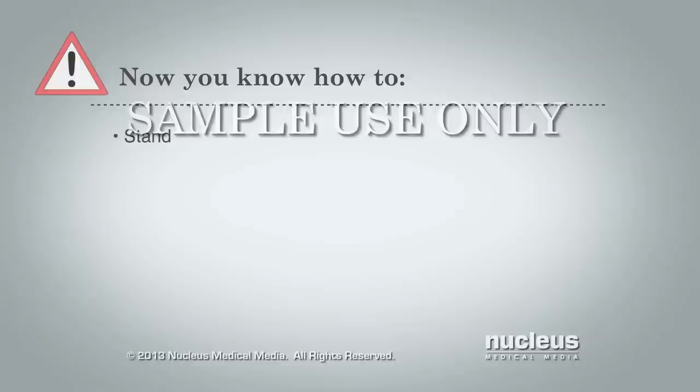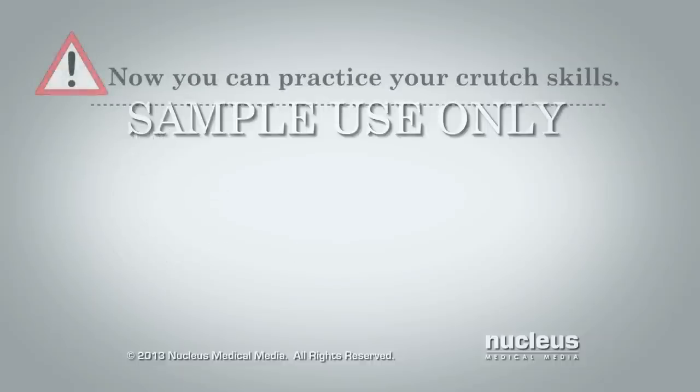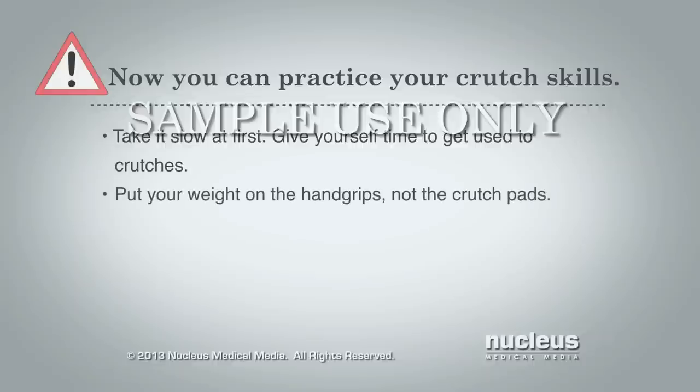Now you know how to stand, sit down, get up from a chair, walk, and go up and down stairs with crutches. Remember to take it slow at first and give yourself time to get used to crutches. Support your weight on the hand grips, not the crutch pads. And ask for help when you need it.